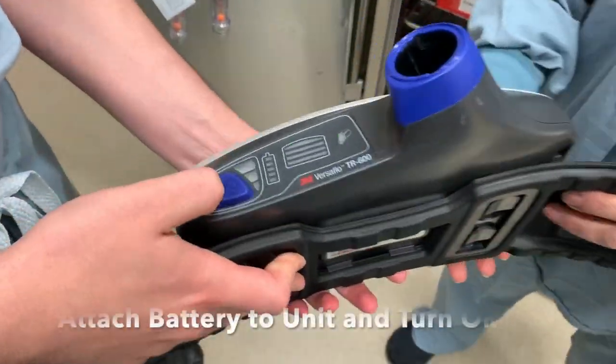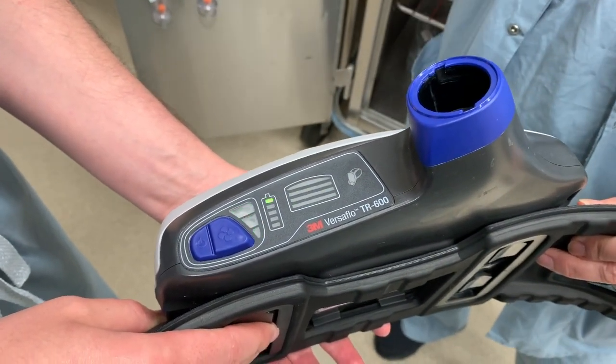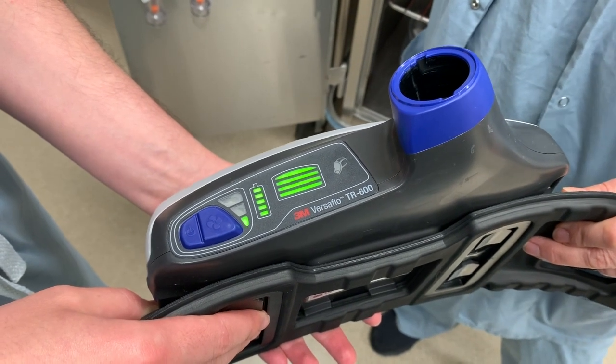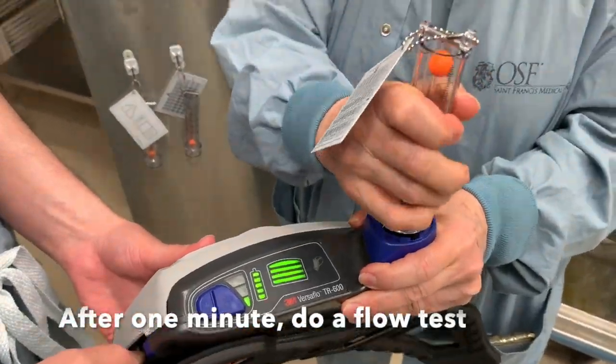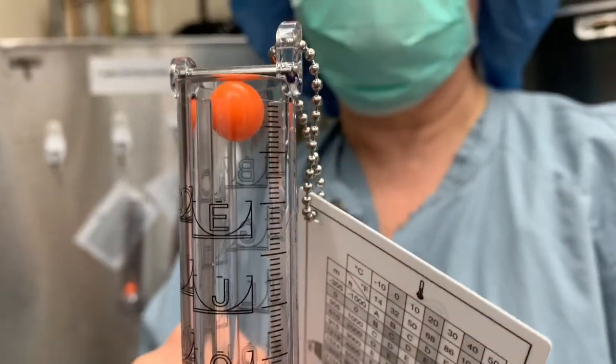You would then hook up the battery to the pack and turn it on by pressing the power button. You need to have it run its check and make sure the green light turns on. You leave it running one minute and then do a flow test making sure the ball is above the level E.